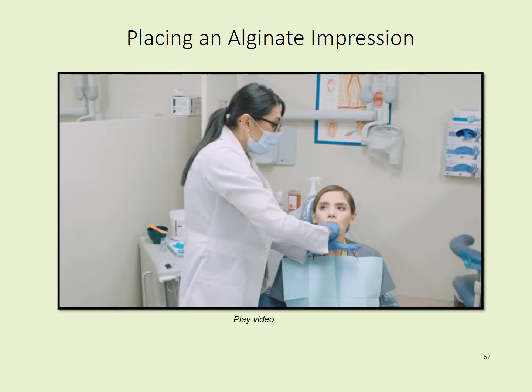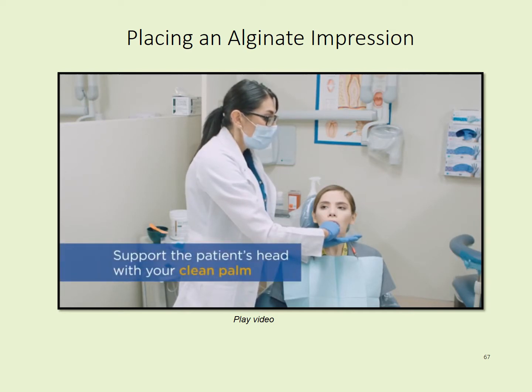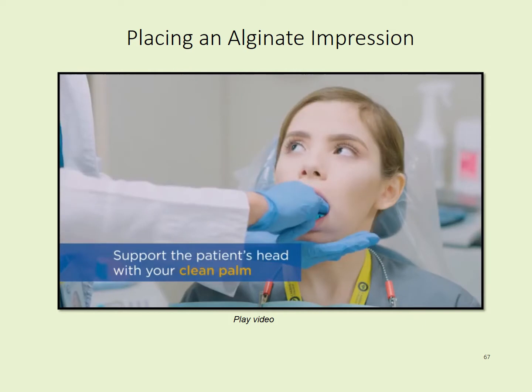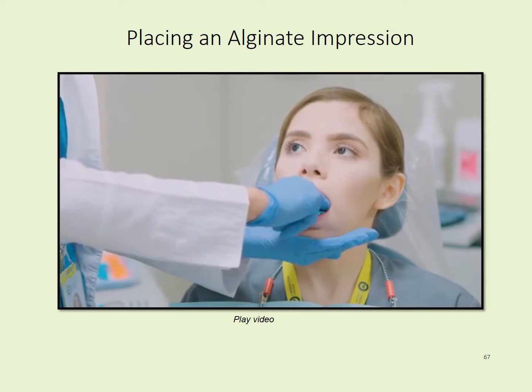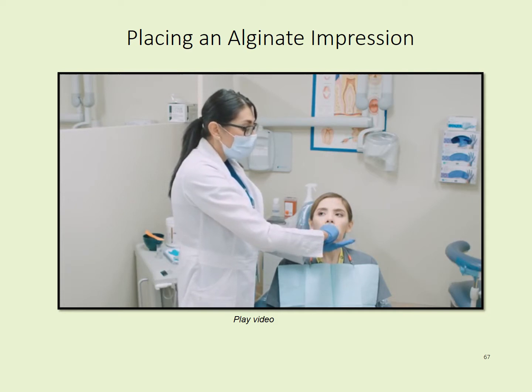Then we are going to go ahead and support the jaw with our hand like so. Okay? Now we will have alginate material on our fingertips, but not necessarily on our palm. And we can use our thumb to press the material and see if it is set. So now our alginate material has set, and now we want to remove the tray.